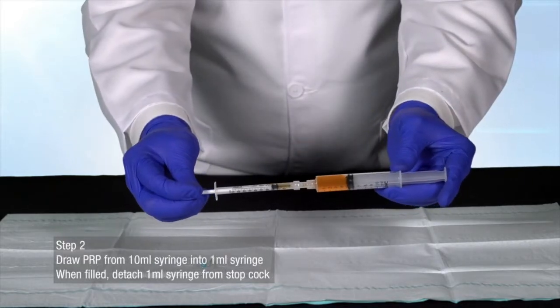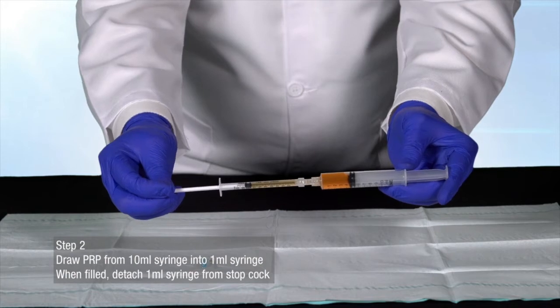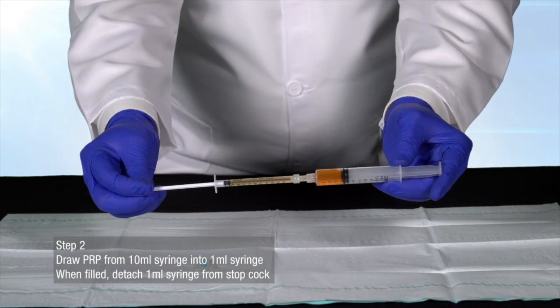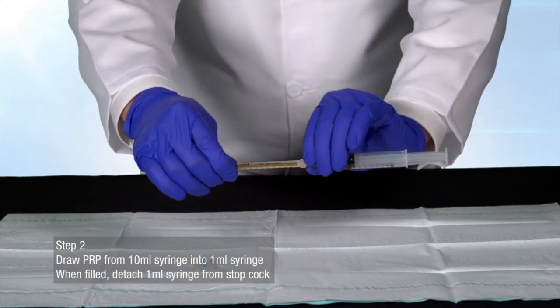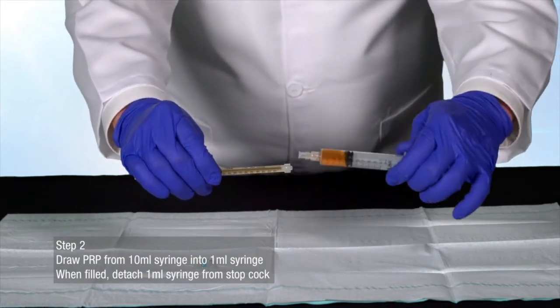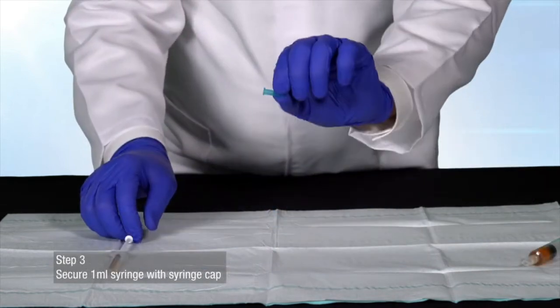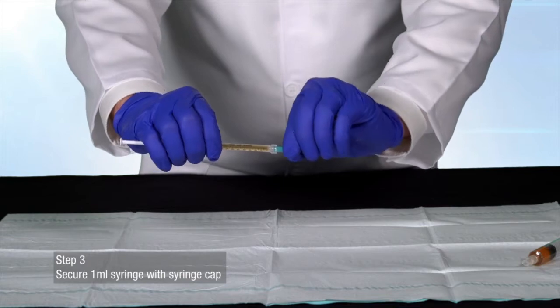Draw the PRP from the 10 milliliter syringe into the 1 milliliter syringe. When filled, detach the 1 milliliter syringe from the stopcock. Secure the 1 milliliter syringe with the syringe cap.